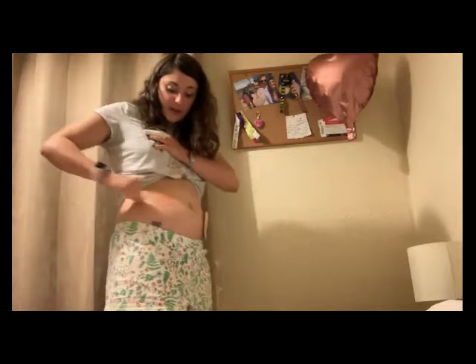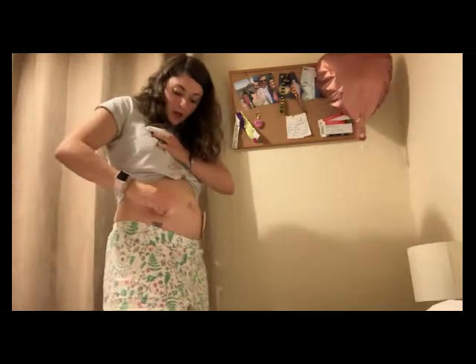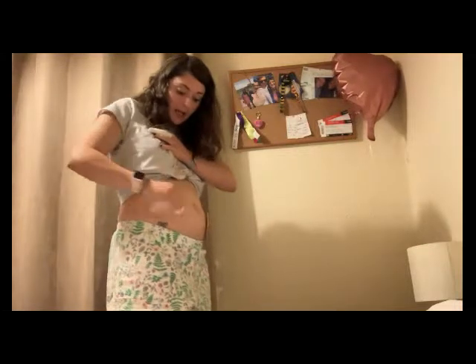So yeah, I'm hoping then, because it'll send an alarm to my phone if I go too high or too low, I'm hoping that will help me a bit better, because I've been told by the doctors as soon as Dexcom come on prescription I can have it, but it's just not on prescription yet, and I think it's going to be a waiting game. I think it's just way too expensive for the NHS.